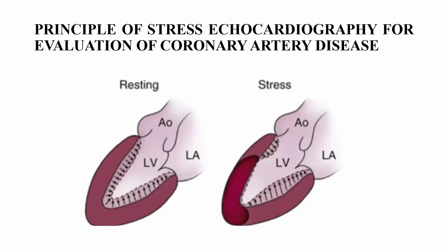Now, when you are resting and you are contracting in systole, you notice that the endocardial border moves inwards and the walls thicken, as is beautifully illustrated on the left side of the screen, where you see thickening with the endocardium moving inwards towards the cavity in end systole.